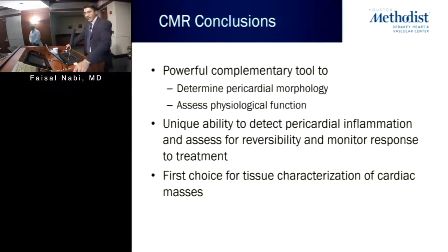So our conclusions for this talk is that CMR can be a very powerful complementary tool, not only in determining pericardial morphology, but concomitantly being able to see the physiological effects of the pericardium on the myocardium. And I hope these cases have demonstrated that. Second, CMR has the unique ability to detect pericardial inflammation.